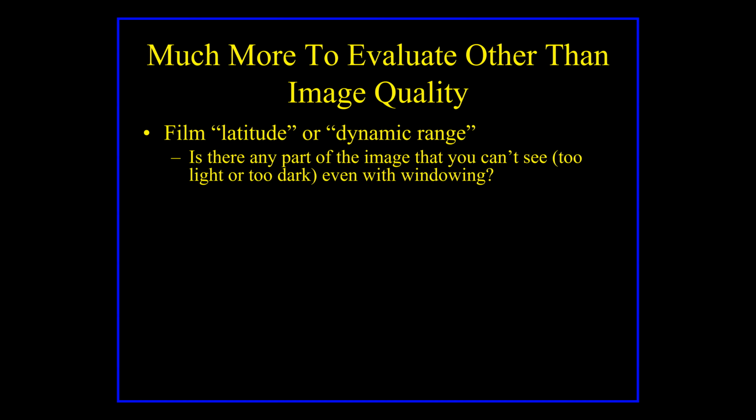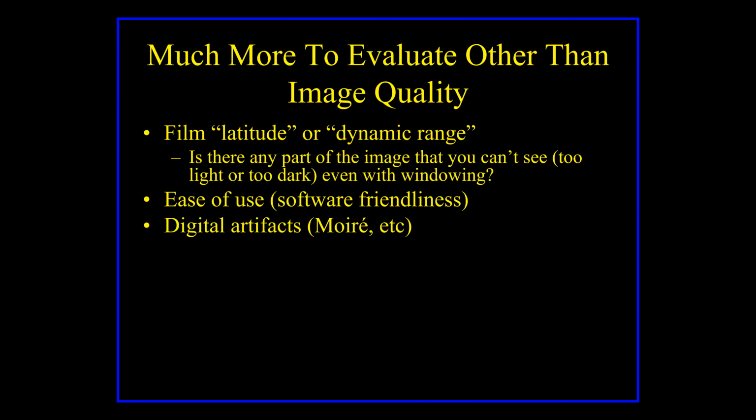And y'all grew up in a whole different time than I did. And so everybody's very computer savvy with you guys. So this will probably be real easy for y'all to understand. So you have to evaluate not just the X-ray system, but you have to evaluate the software that comes with it. Is it user-friendly? Does it take 30 clicks to get an exposure, or does it take 3 clicks to get an exposure? Things like that.